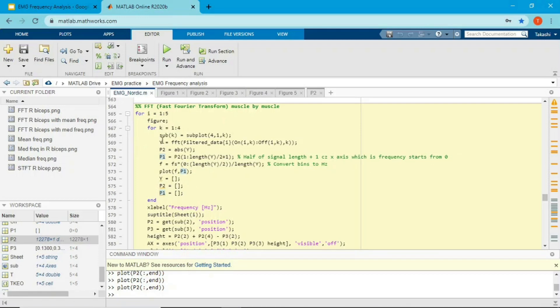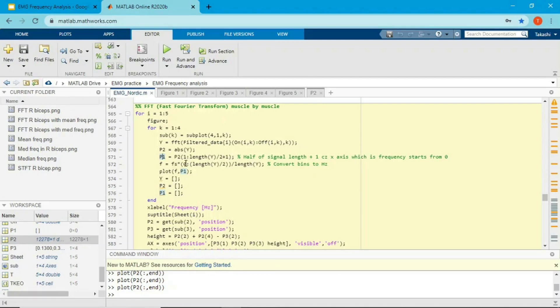The y-axis is amplitude from FFT, and I define the x-axis separately. Without this, x-axis would just be bins like a histogram. This line converts bins to hertz. The formula takes the length of the EMG from 0 to half the length (since I converted double-sided to single-sided), multiplies by the sampling frequency of 2000 Hz, and divides by the total length of the EMG data.